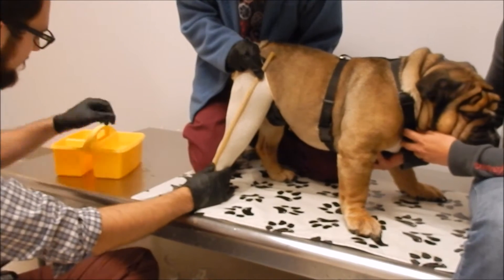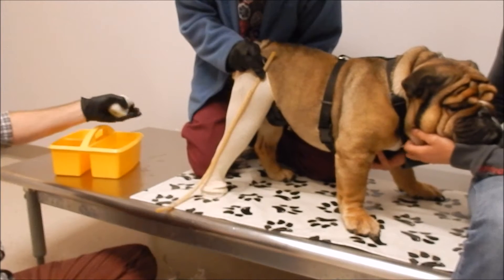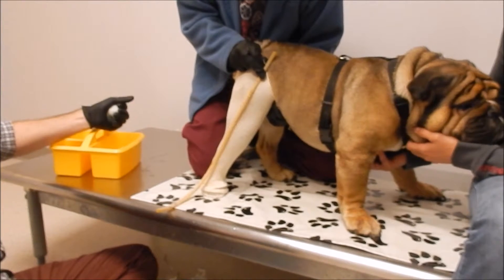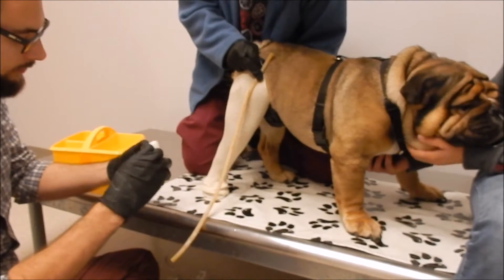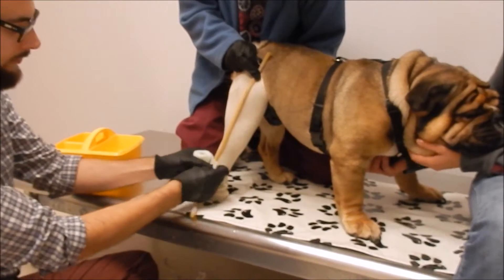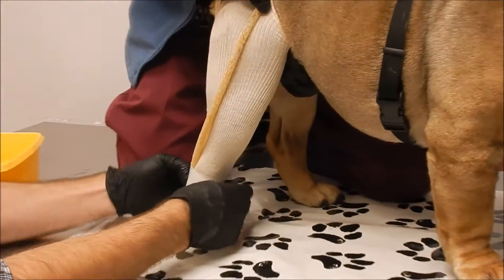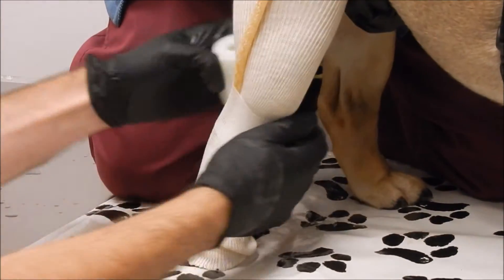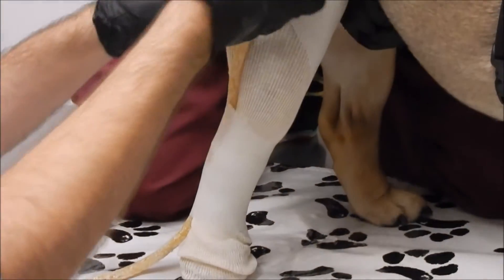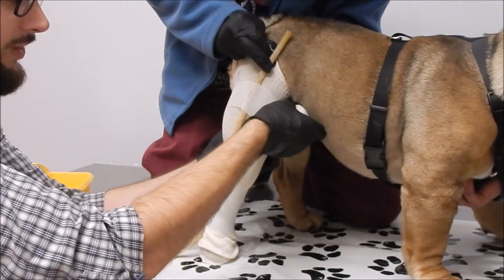I'm going to squeeze a lot of water out of it. When I'm doing this, I want to get just a few little wraps over the whole thing first, and then I can find spots that are a little thin and fill everything in. It's just easier to get it going first and then find the thin spots.